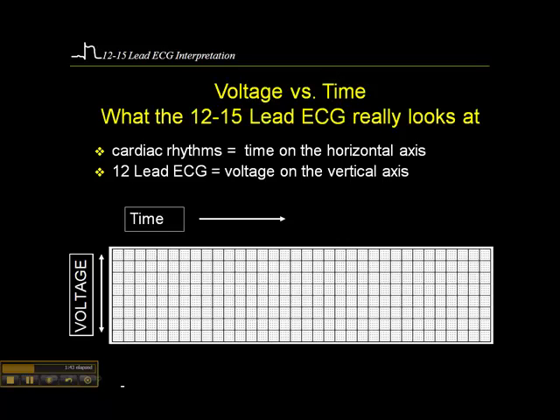And so everything in a 12-lead is really voltage related or axis related or vector related. When I say vector axis, what I'm referring to is the deflection, for example, of the QRSs. So if the QRS is deflected negatively, that's a negative vector, if you will.